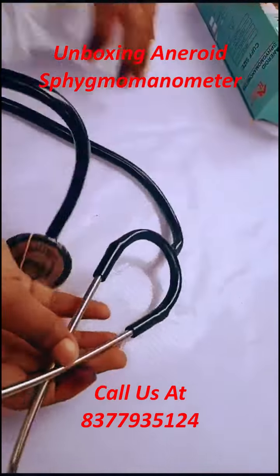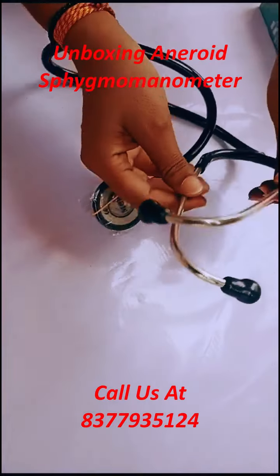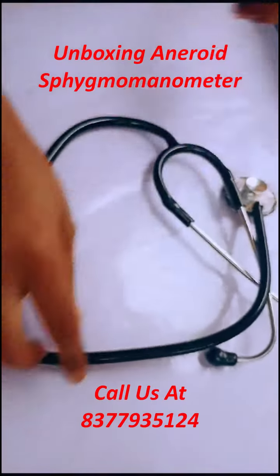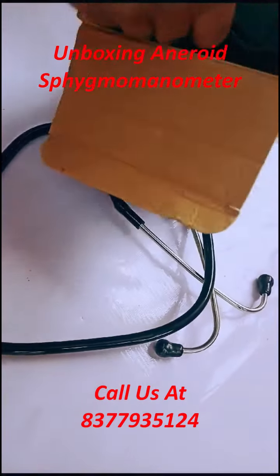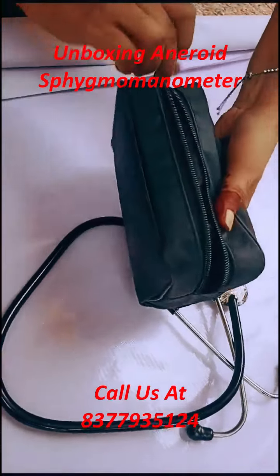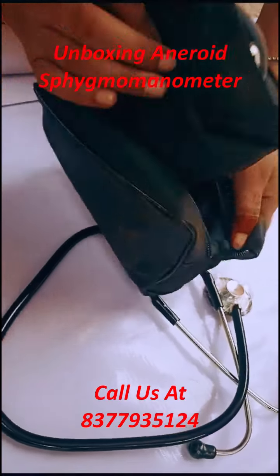A sphygmomanometer is an instrument for measuring blood pressure. It often consists of a cuff and inflation system. At the end of the inflation tubing there is an inflation bulb and measurement apparatus such as a manometer to read measurements.